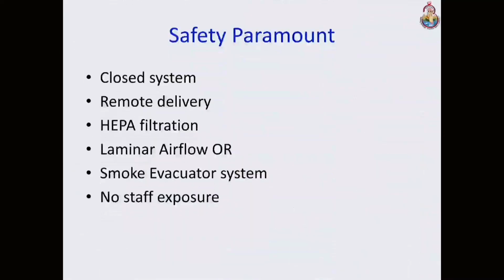So safety remains paramount, although this procedure looks very safe overall, but you have to be very careful while using it. It's a closed system. There should not be any contamination of the OT. The OT should preferably have a laminar airflow, HEPA filtration, or a closed system. If you don't have that, you have to have a smoke evacuator system so that the exposure to the staff is negligible. Although there have been many studies that even otherwise exposure into the OT atmosphere is minimal, negligible. But over a period of time, it can cause harm, which nobody knows as of now. So it's best not to have any exposure to the best of our ability.